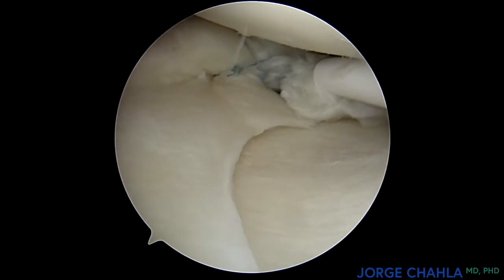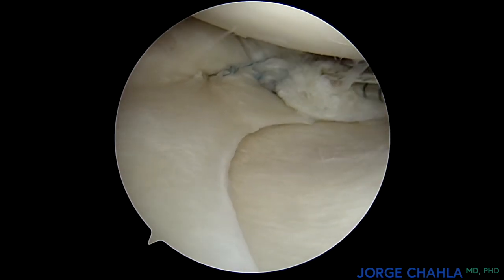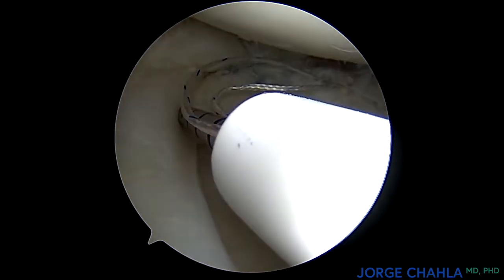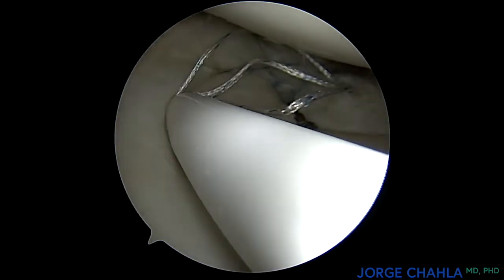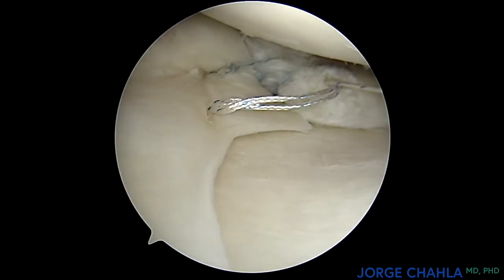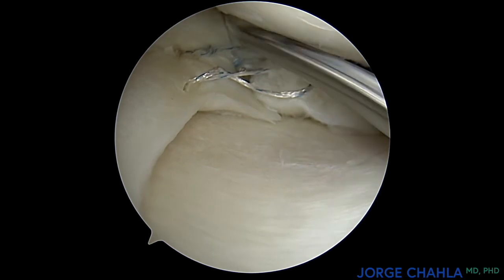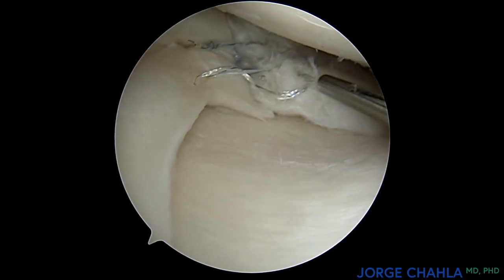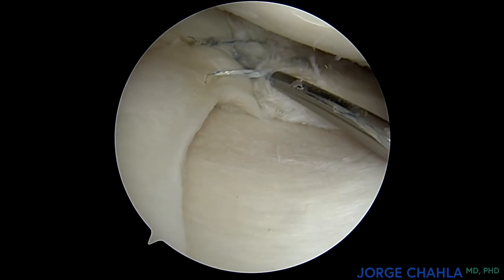A second suture is then placed inferiorly at the same distance on the anterior and posterior aspects of the meniscal tear. Again, appropriate tension is confirmed under direct visualization.